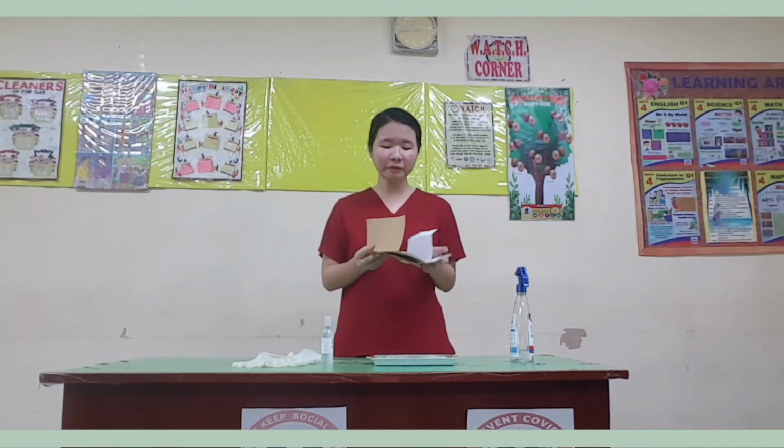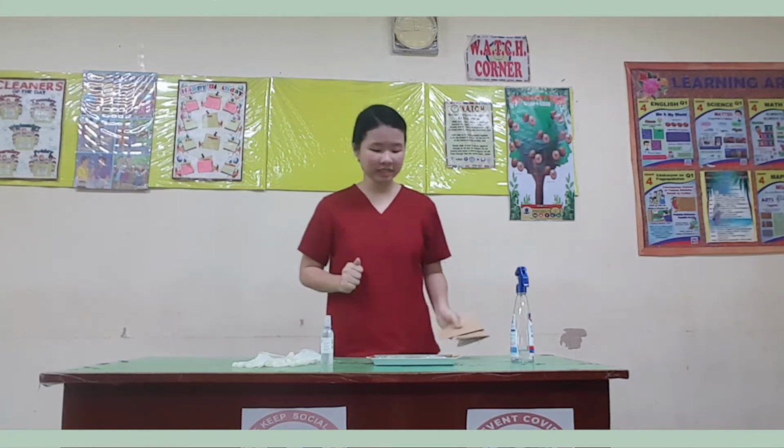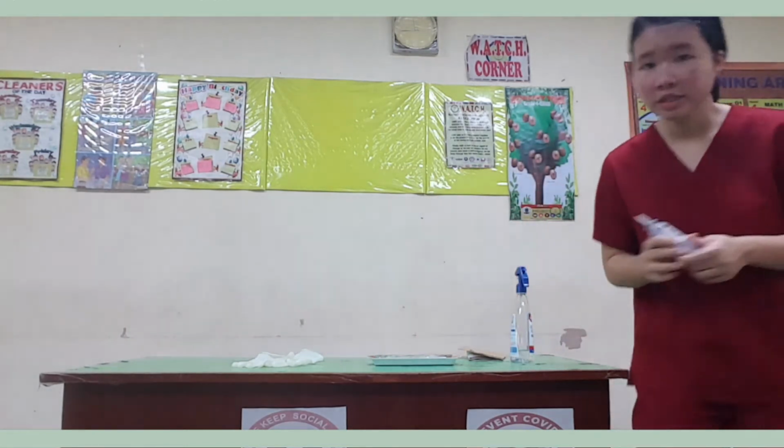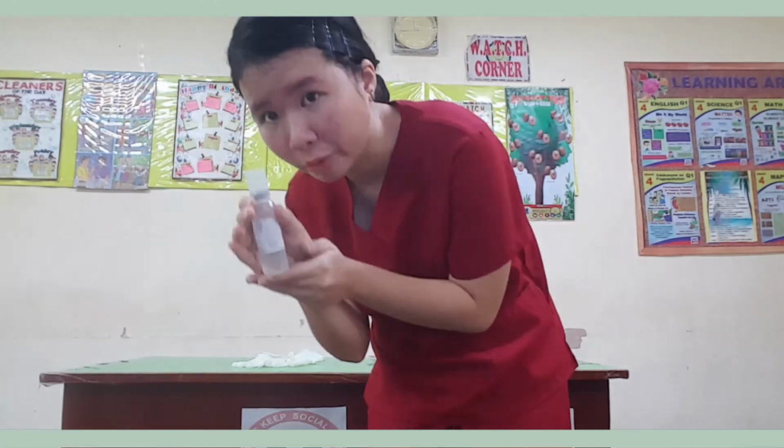So for procedure number 6, we need to check for the expiration date. This is for the safety of the patient. So based on what's written here, it is going to expire on 10/22, so next year, October 2022. So it is still consumable.